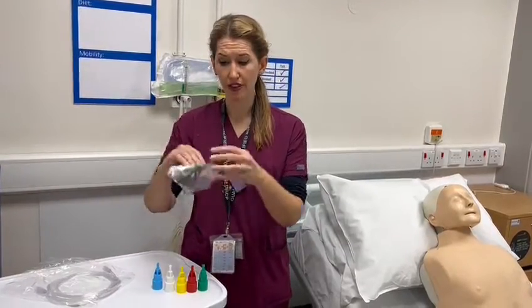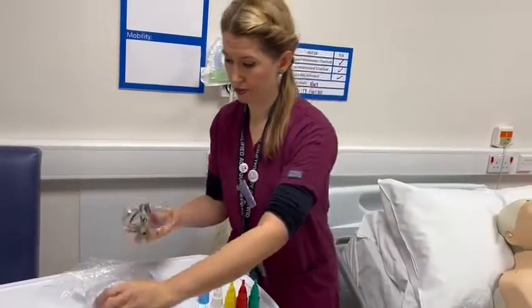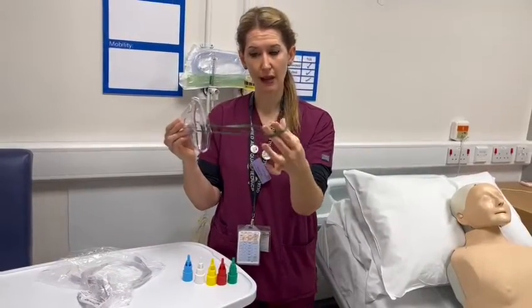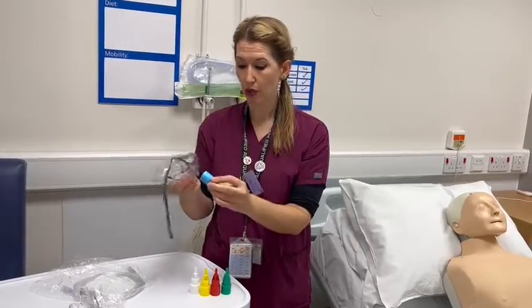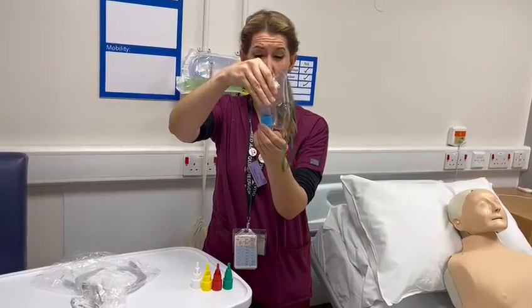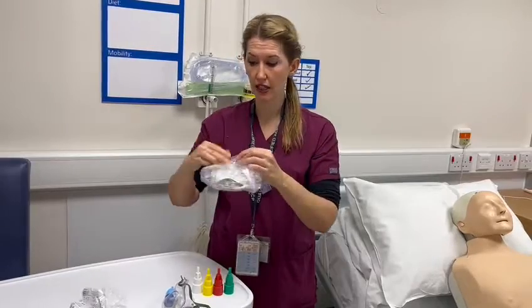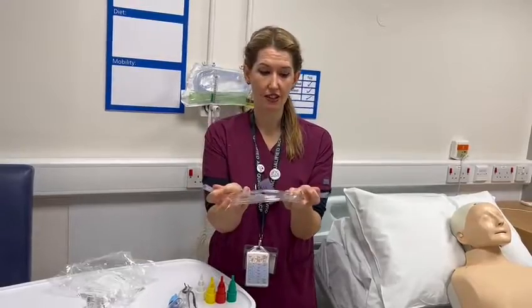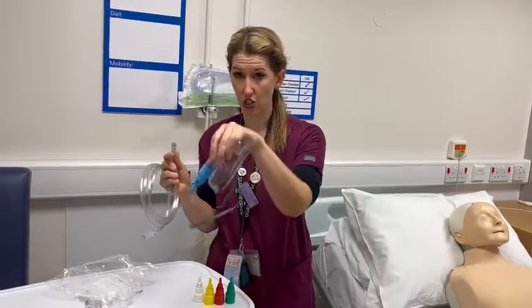I will then get my simple face mask. I will open that up. You'll see that you've got a green string elastic band that will go around the back of the patient. I will then get my blue one and screw that onto the bottom — you literally just push it on. I will then get hold of my oxygen tubing. The oxygen tubing is the same at both ends, so it doesn't matter which end you attach to the bottom of your Venturi device.